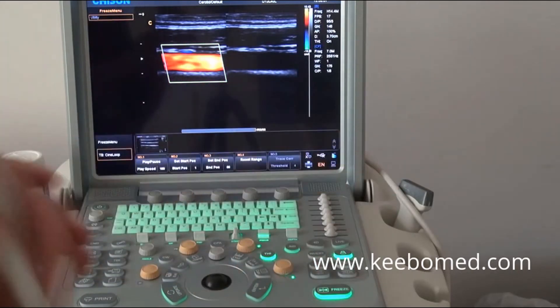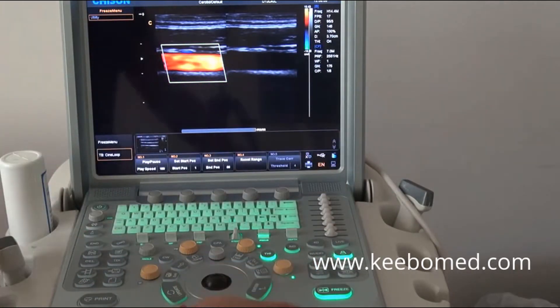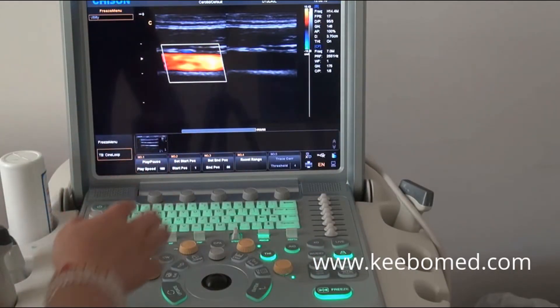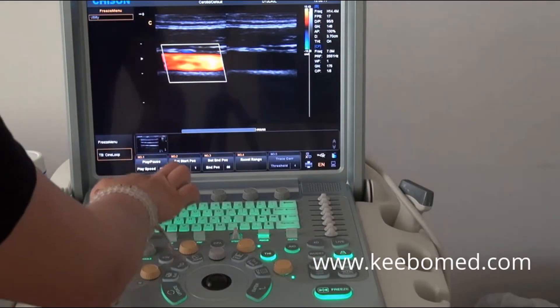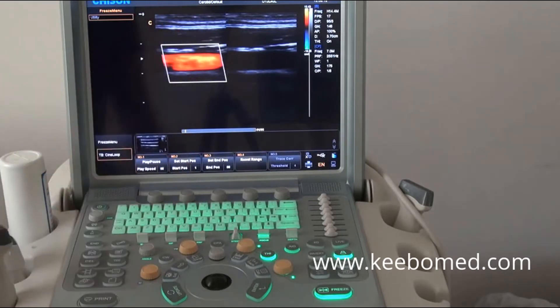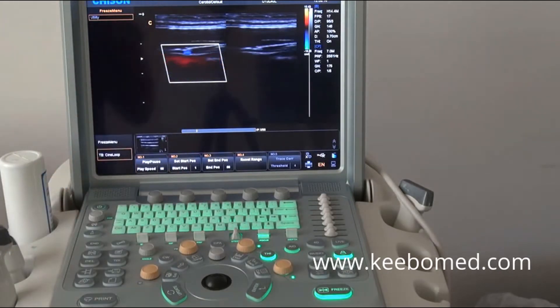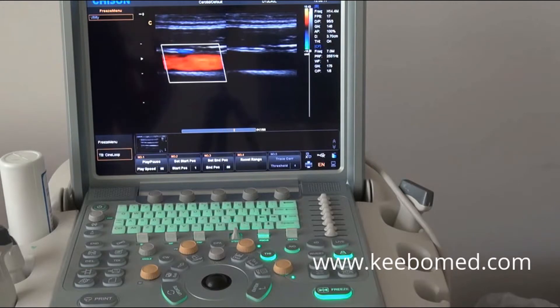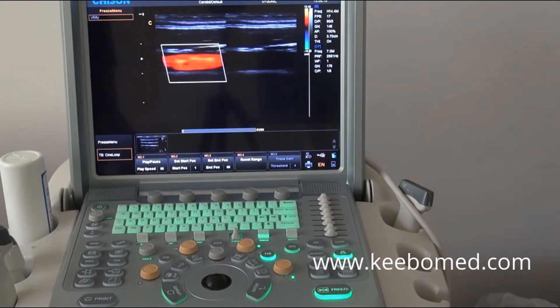After that, you freeze the image. You can also replay the scene — press play and pause. It will replay the scene you have just scanned.